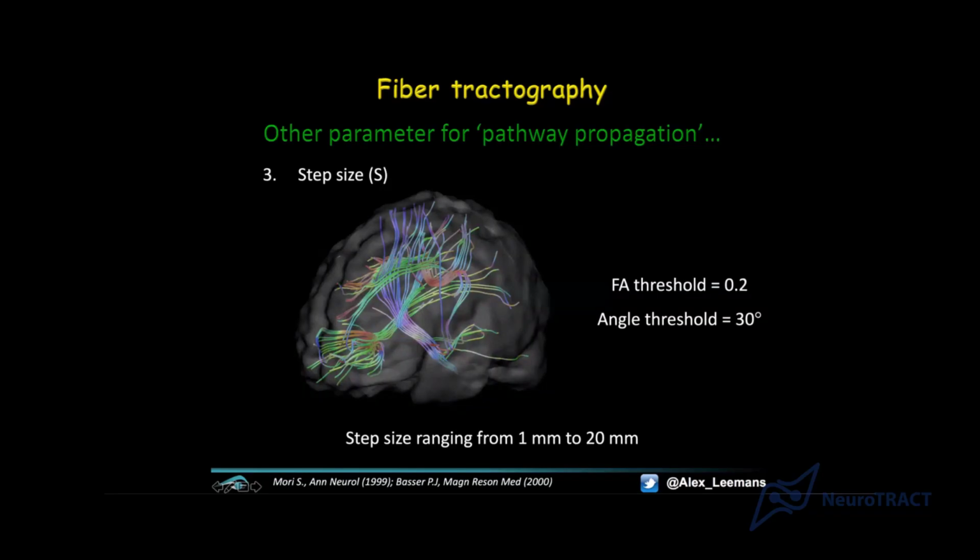Step size. Good. What I'm showing you here is an animation, and I'm going to change the step size from... okay, there's a question. I don't understand how step size is different from voxel size. Okay, voxel size is literally the dimensions of the voxels of the data that you acquire. When you acquire data, the data is discrete. Think of a two-dimensional photo with your phone. It has pixels. These pixels have dimension if you're acquiring a genuine object. When you take a picture, these pixel dimensions don't mean anything. The importance there is the dots per inch, the density, or how many pixels.